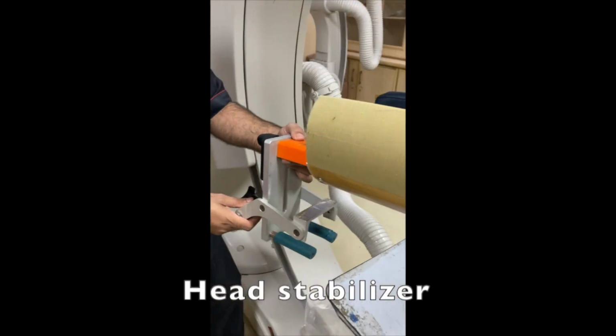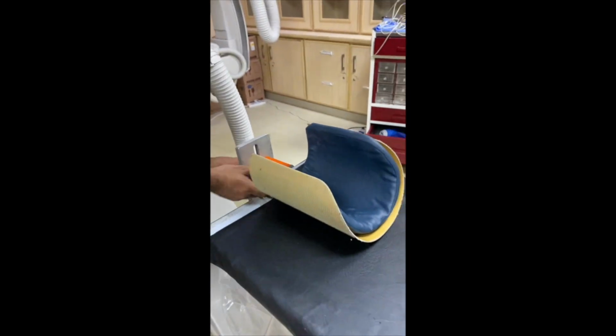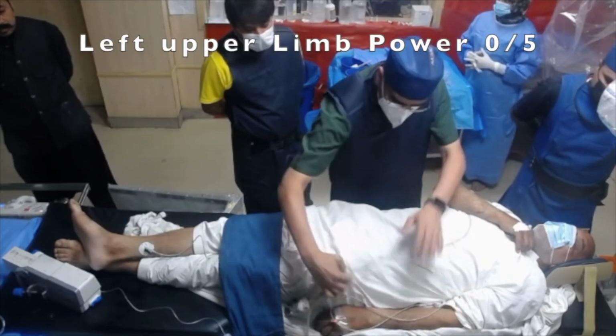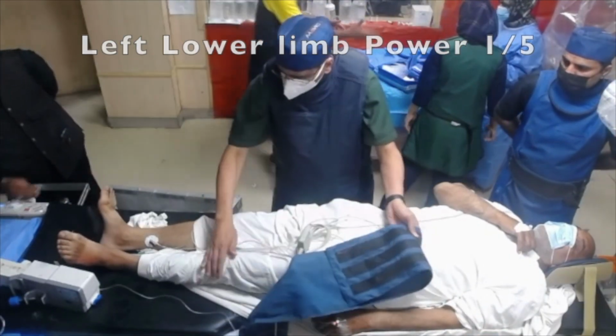Now this is the head stabilizer that we use in the cath lab, and we are able to tilt the head whenever required. Pre-procedure examination on the cath table revealed a power of 0/5 in the left upper limb and 1/5 in the left lower limb.